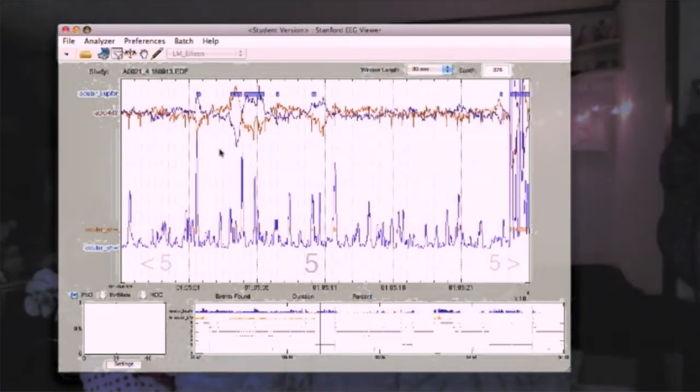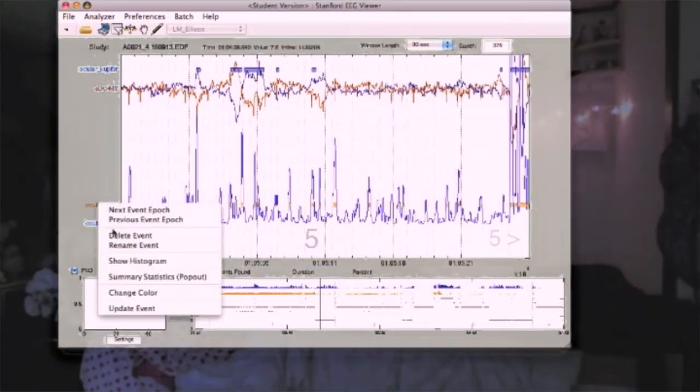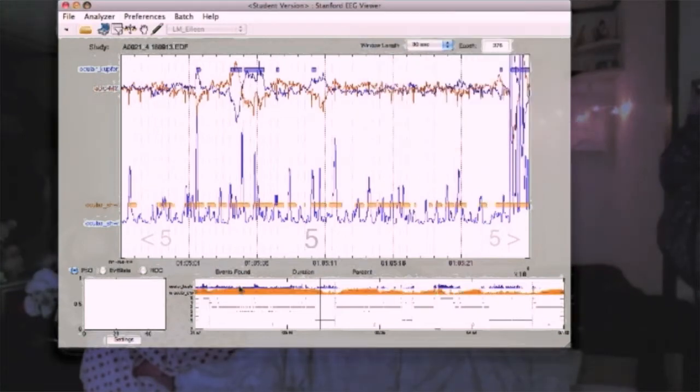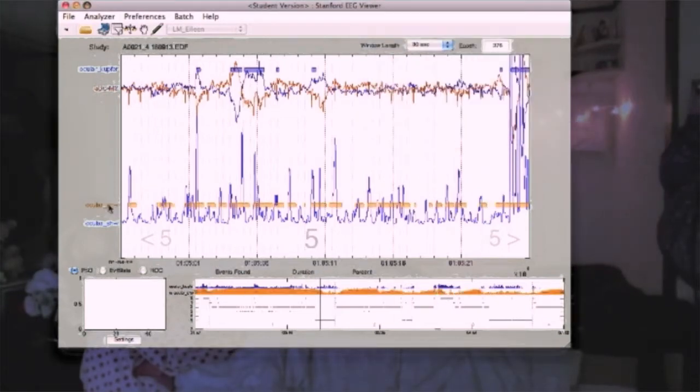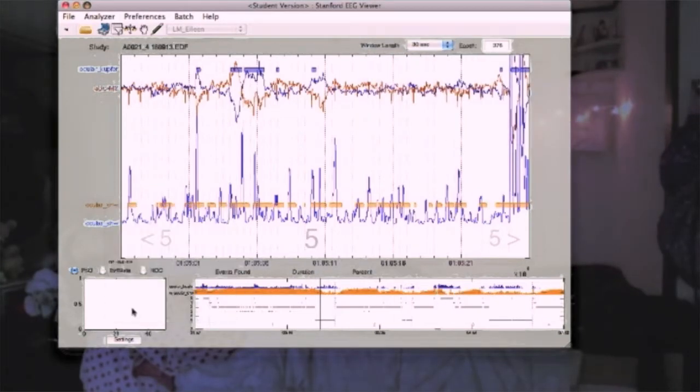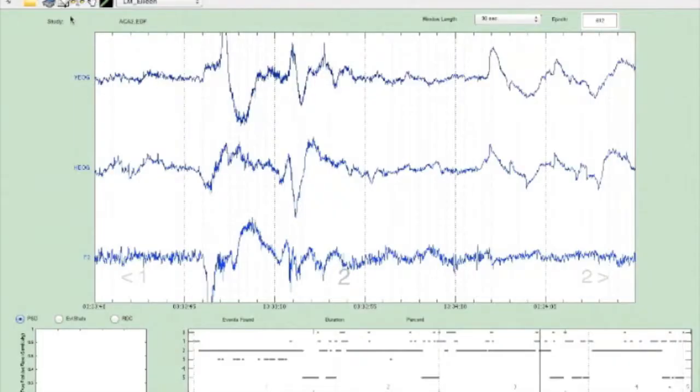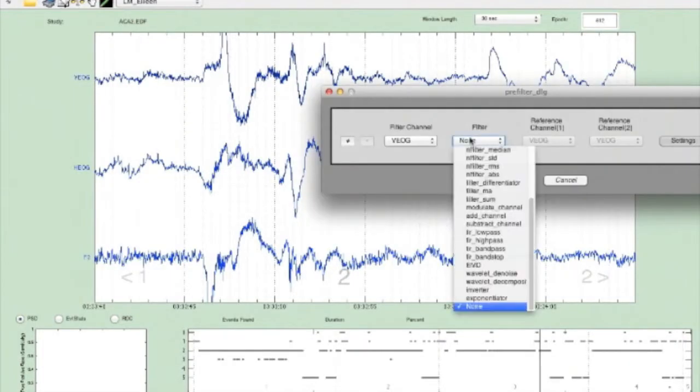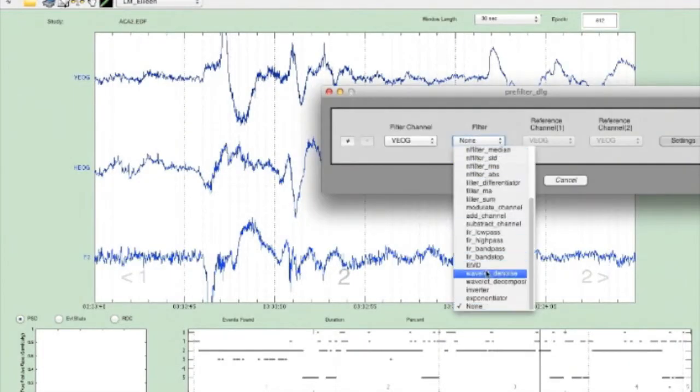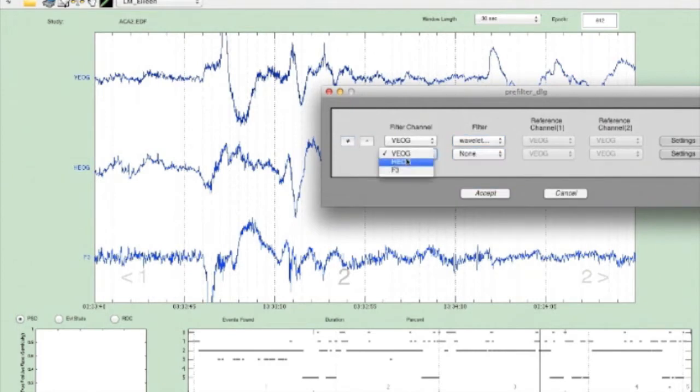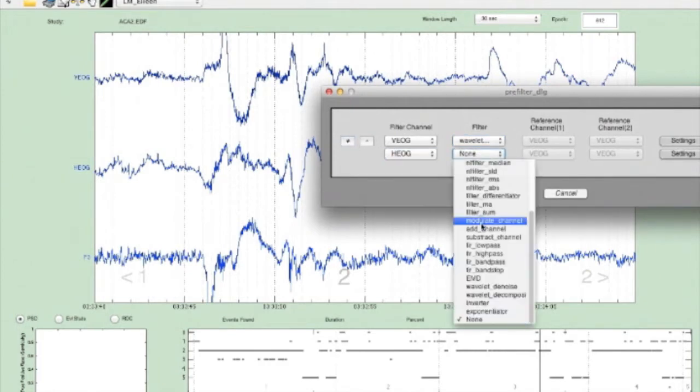Detection algorithm-specific parameters are adjustable on the fly, letting users see the effects of different settings on their data. PSG data is often contaminated with unwanted artifacts or noise, which often leads to erroneous detection results.